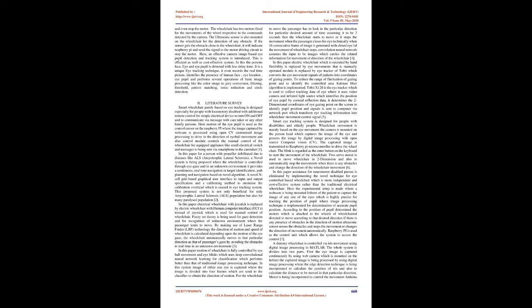Fuzzy set theory is being used for gaze detection and for recognition of the unknown environment where the passenger tends to move. By making use of laser rangefinder, LRF, technology, the direction of motion and speed of the wheelchair is calculated depending upon the motion of the eye gaze. The wheelchair automatically moves in the same direction as the passenger's gaze, avoiding obstacles in real time in an unknown environment.